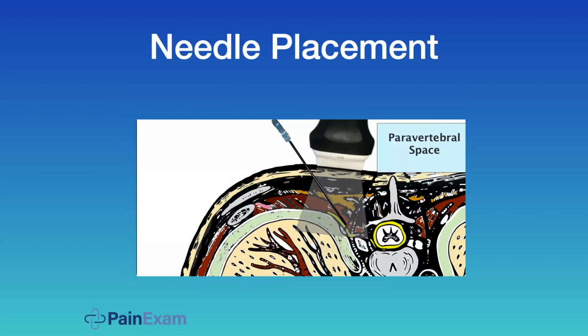So why am I doing paravertebral nerve blocks in the pain office? Well, I see patients who've had spinal cord stimulator insertion pain at the thoracic level. I have patients, and they respond beautifully to this. I've had patients who have thoracic radiculopathy from a disc herniation in the thoracic level. Less common than cervical and lumbar, but I see it. And in my opinion, it is safer to do an ultrasound-guided paravertebral nerve block than an epidural at this level because there's no spinal cord where I'm working. Are there arteries? Yes. You have to be very careful, and I often use dexamethasone and not a particulate steroid.